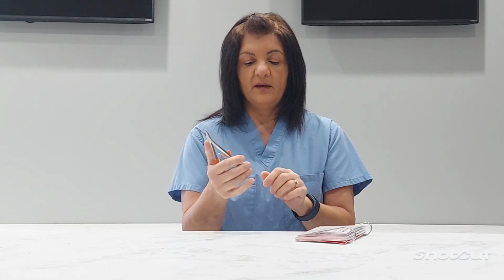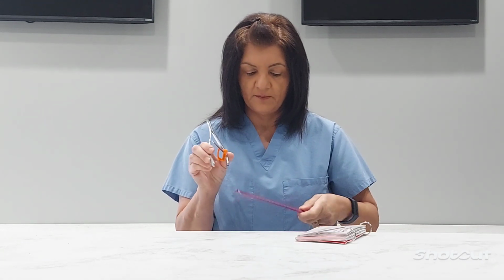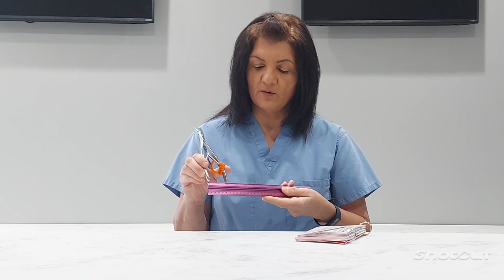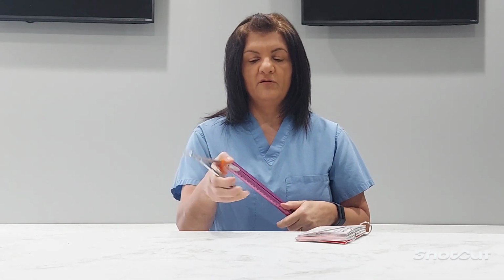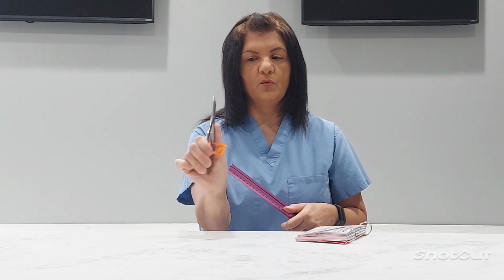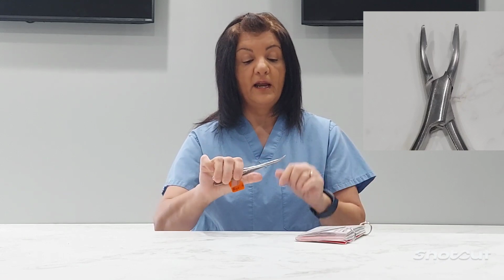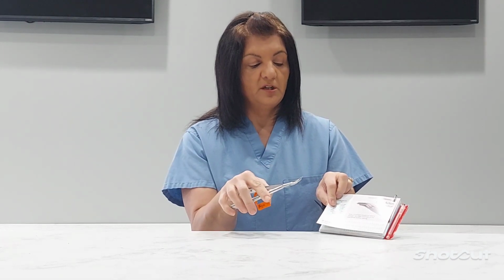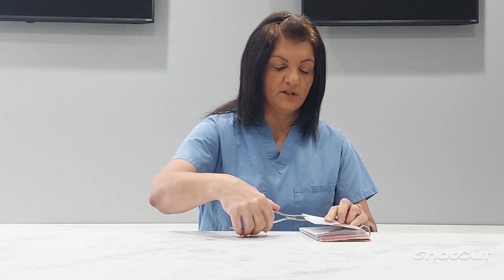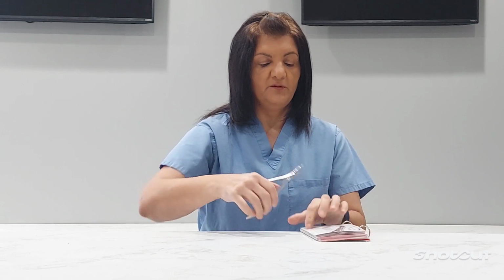So when I'm testing for function, I'm squeezing the instrument. It really should never come this close together. It really should be about 2 inches. So if I'm measuring 2 inches, where it really should be when I squeeze it as hard as I should squeeze it, you'll notice that the tips don't even come together. So if I'm the doctor and I'm squeezing this hard to get this instrument to work, there's a problem. And it doesn't feel right. It feels very loose, probably because of this giant crack right here. If this instrument was actually functioning properly, it should be able to cut this card and take a little bite out. So I would just take it like so, take a little bite and it should snap a little bite out. This one doesn't even make an indent in my card, so this one's going to the repair bin.